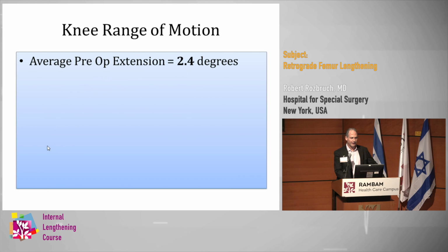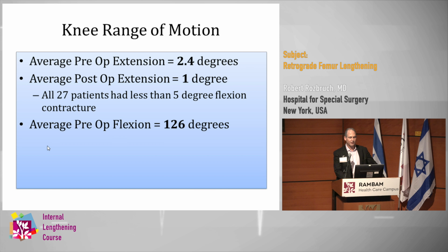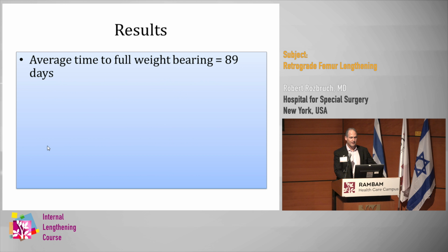Knee range of motion really was not an issue. You can see there were some mild temporary contractures, but we really did not have any change in knee range of motion with this. But again, to the point that was mentioned, these are relatively small lengthenings, no really big lengthenings. This is the typical range of motion at the end. They were full weight bearing within 89 days. The Paley scores were noted, and there were really no complications in terms of infections, fractures, or insufficient regenerate, and no mechanical failures and no joint dislocations.